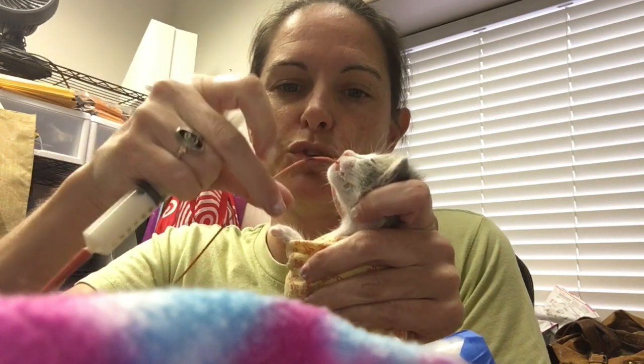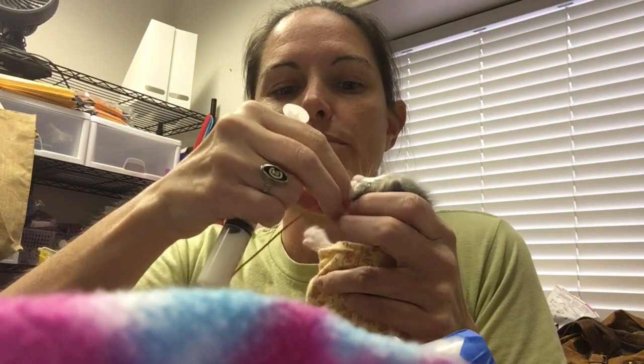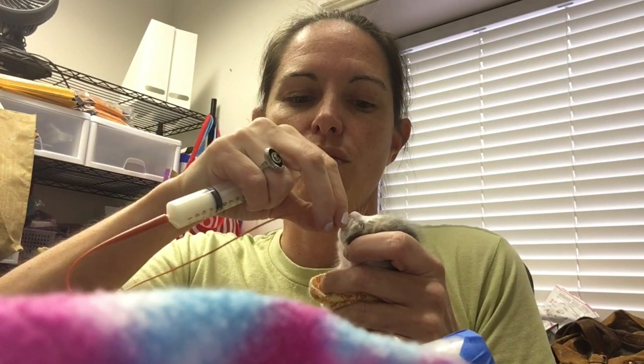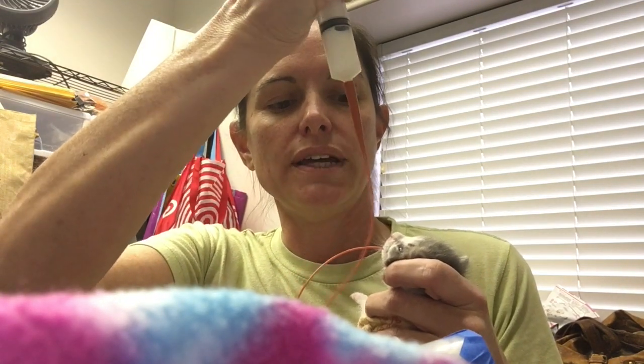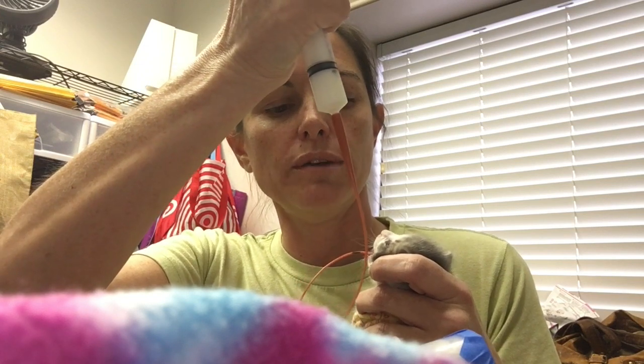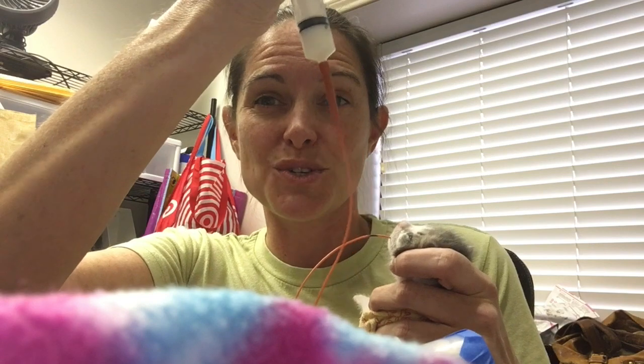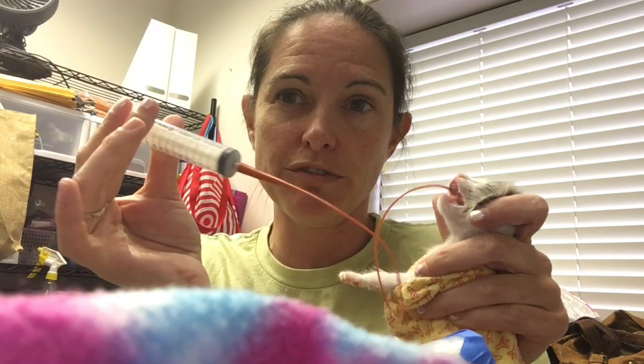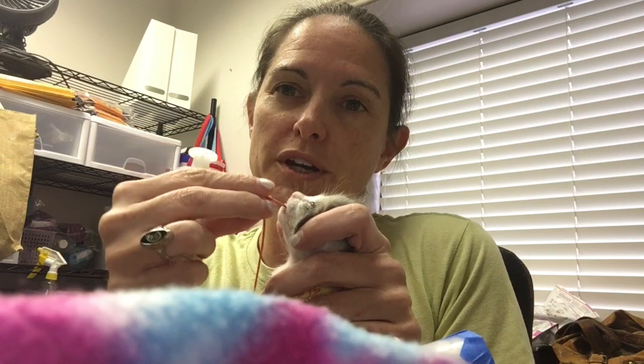Every time he cries, you see how the tube is moving? You want to just push that back. Sometimes what you can do is actually hold it in the front too. You hear all that gargling? That is actually mucus in the back of his throat. And then once you're done, you go ahead and fill up the milk, grab the tube, pinch it and then pull it out.